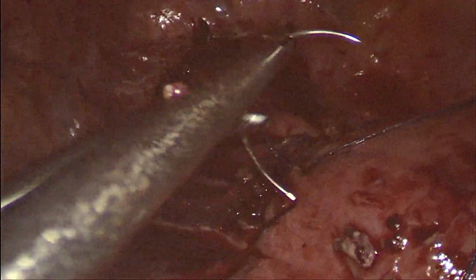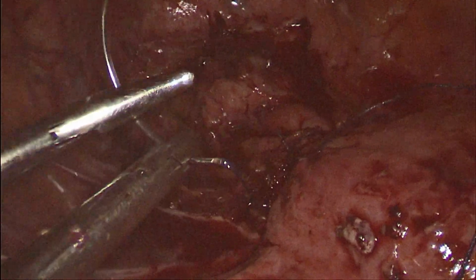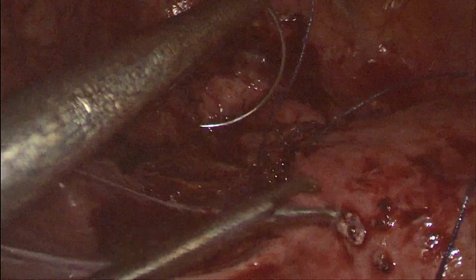So this is the final stitch we are taking at the left end of the scar. So the full length of the scar is approximated from left to right.